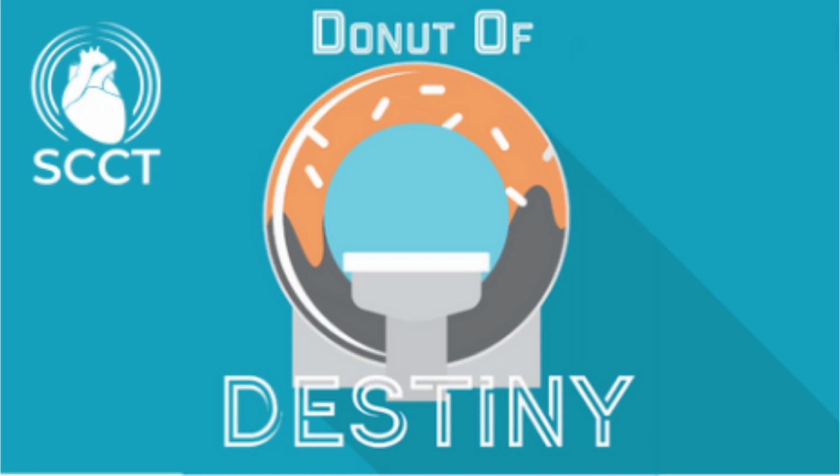And now, on to the topic of today's episode. We will be discussing HALT and the Partner 3 CT substudy. HALT is a concept that has gained a lot of traction in the imaging journals recently and is found when we image bioprosthetic valves with cardiac CT. That's both transcatheter and surgical valves.